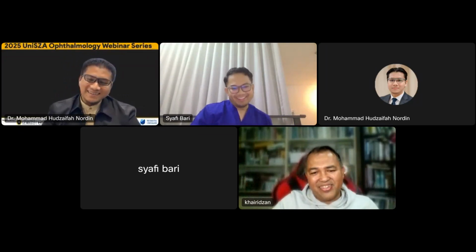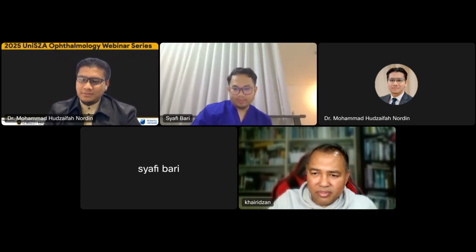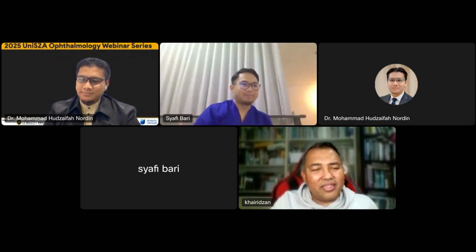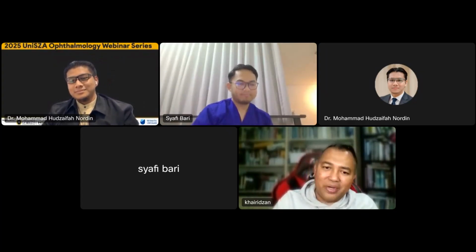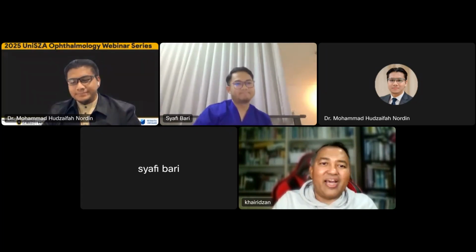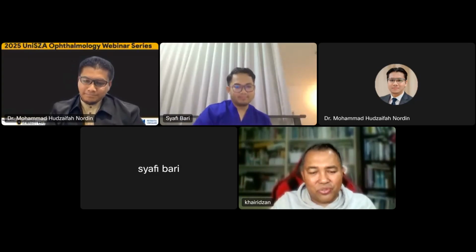Okay, thank you very much. So that is the question by Dr. Kamal. Okay, next question: I asked about contrast sensitivity because it's not been discussed enough. Like when nighttime comes, vision turns bad even though the defocus curve is good. It is important for safety reasons, especially walking at night. Thank you, Prof. Yeah, that is a good question. Exactly. That's why I said the defocus curve is only acuity, but it doesn't tell you about quality. I mean, that's a nice thing to actually raise. Mr. Chang, that's really, really good.